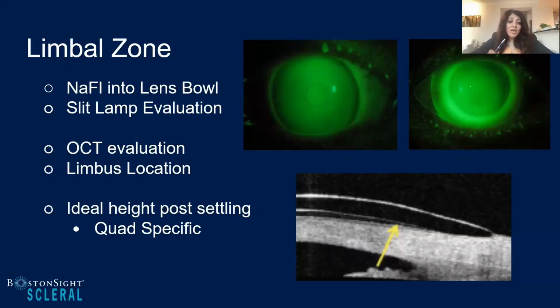And what I love is now having the ability to have the OCT where you can actually scan and see exactly, do I actually have touch or not? And 50 microns, it's a small amount that's hard to appreciate sometimes on the slit lamp. That OCT really helps you to see whether you truly do have touch or not. So when you see an image like this, where it looks like there is some touch at the limbus, you take another closer look and see if it truly is there.